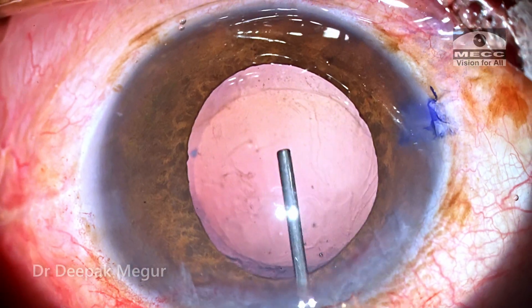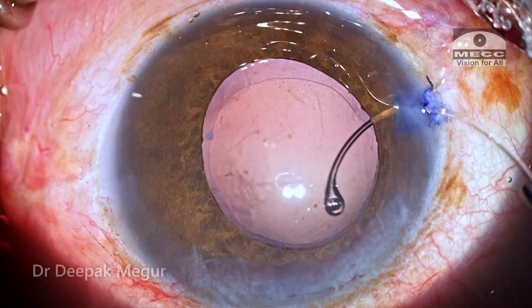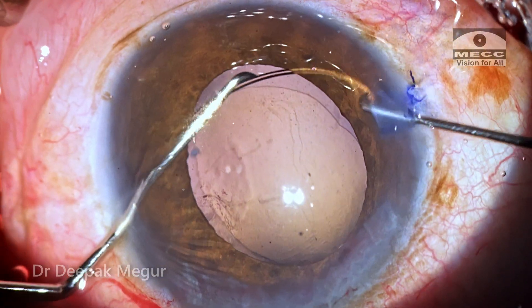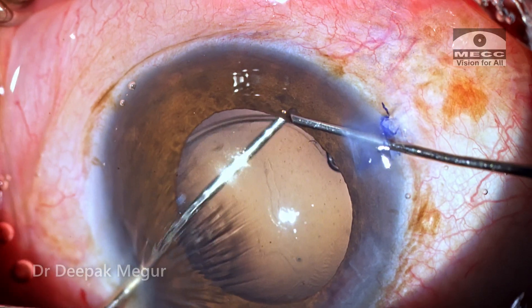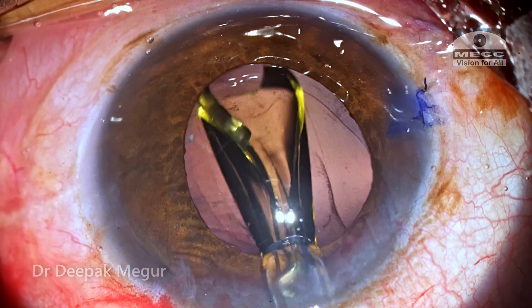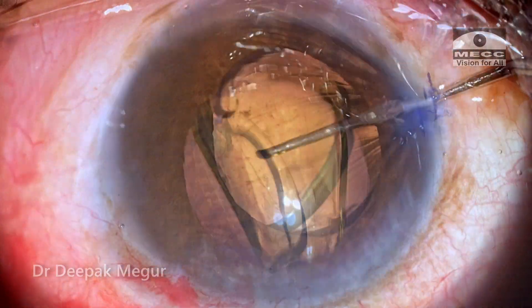The bag is deepened with OVD. Although there was no profound zonular weakness, I still prefer to put in a CTR in this eye because of the long-standing nature of the cataract. The CTR is gently threaded into the bag, followed by injection of the foldable intraocular lens.